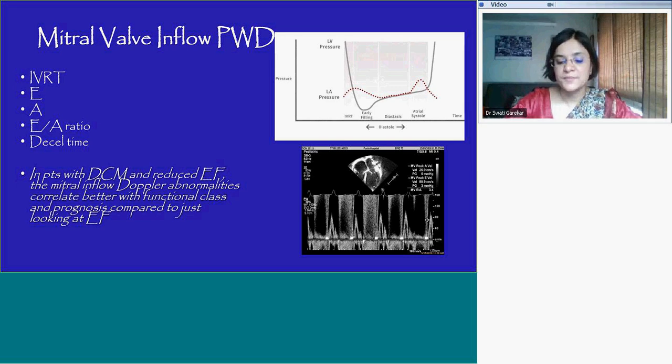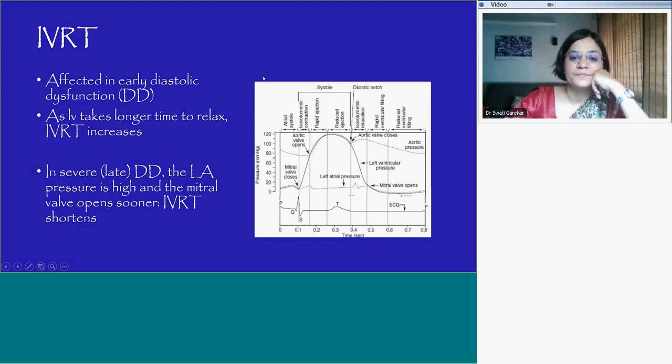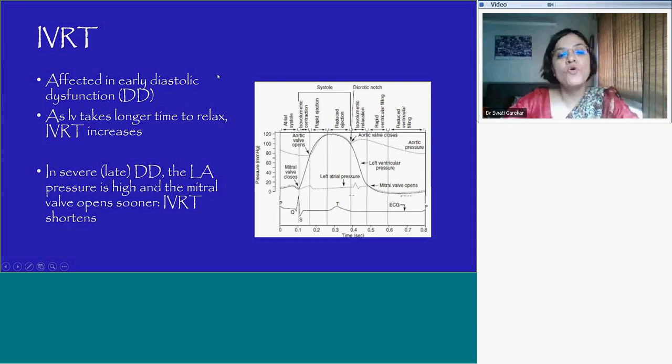Let me get to another slide. The first, before the E happens, is the IVRT.